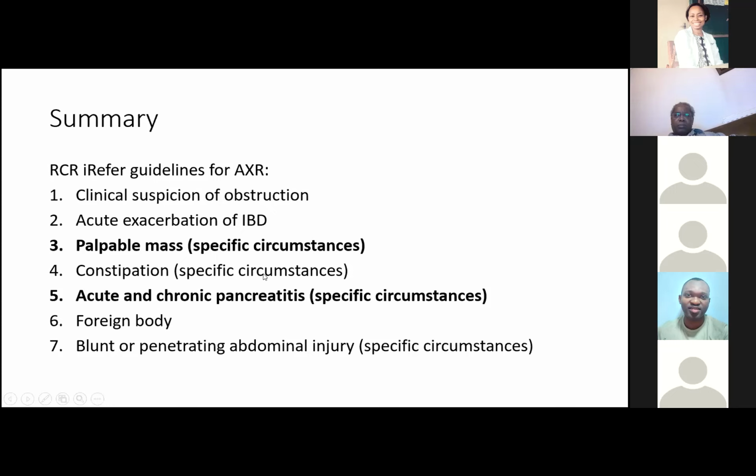You probably characterize how extensive you would, maybe to just plan how extensive you need to resect and things like that. And to Dr. Chasi, would you think it's an appropriate request if one made such a request for a CT scan for a patient who is known to have UC and has got a plain film that has almost all the classical features of toxic megacolon? And the second question is, should you do the first question first, and then you can ask the second question?